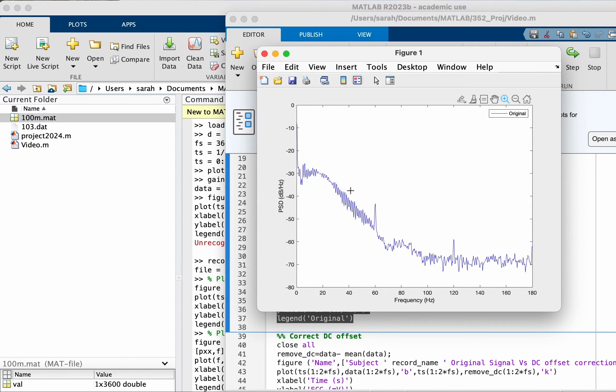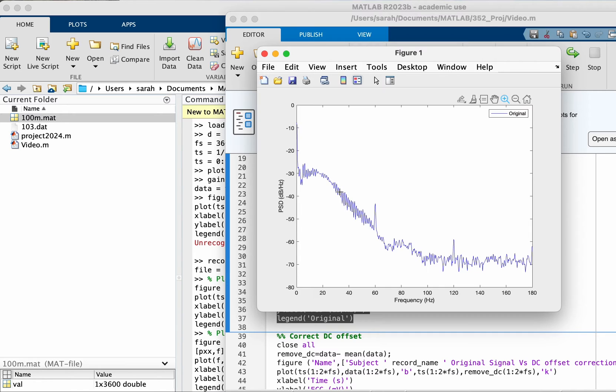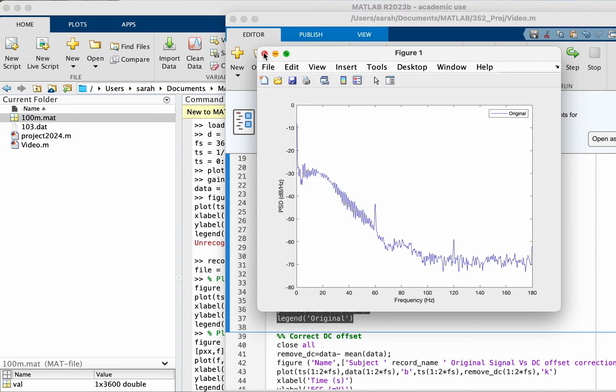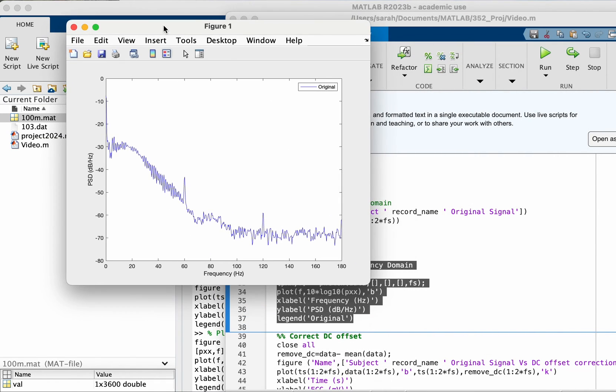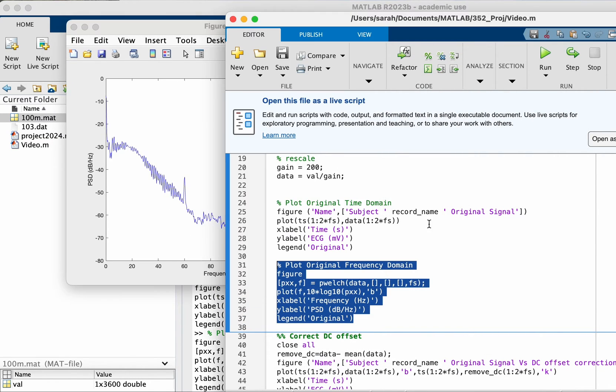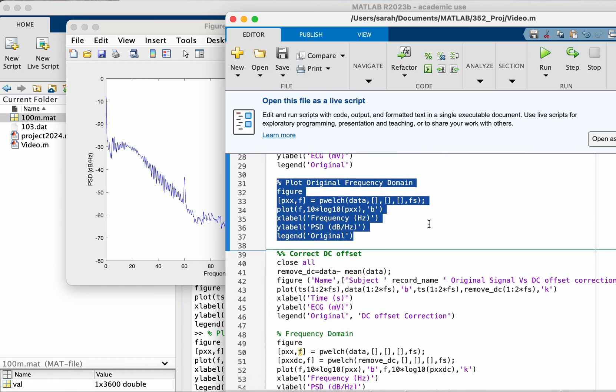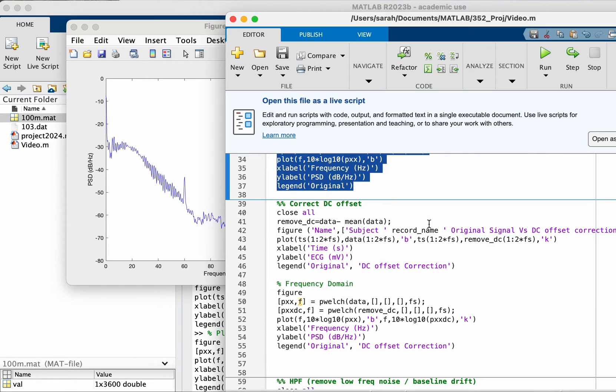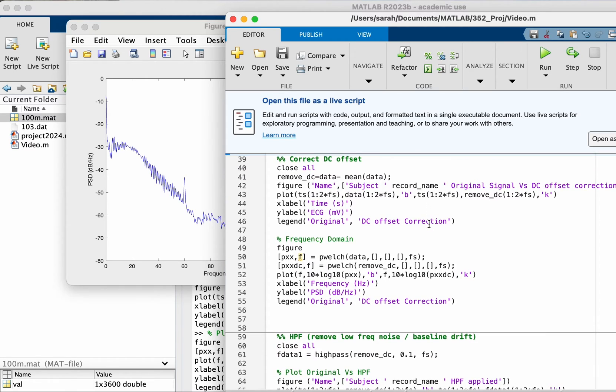This peak at 120 is affecting our signal, we don't want it. So you read in the literature what is the best filtering range for the type of disease you're looking at or for the type of signal you want to study.